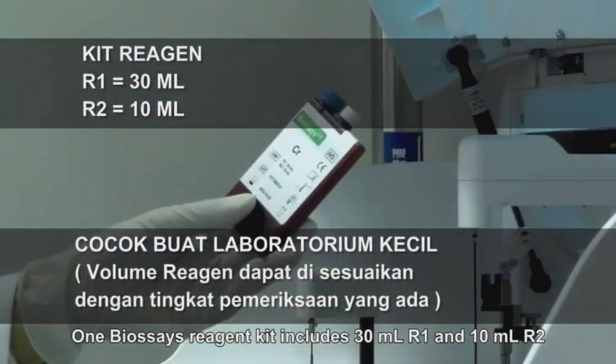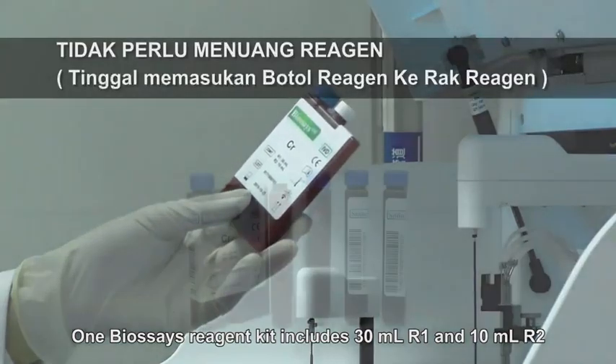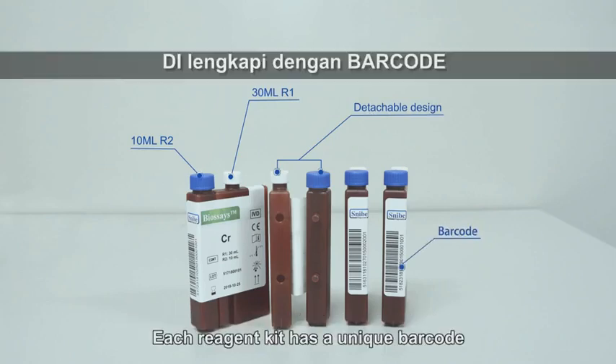One BioSage reagent kit includes 30 milliliters R1 and 10 milliliters R2. The smart design reagent kit enables loading R1 and R2 at one time, and each reagent kit has a unique barcode.